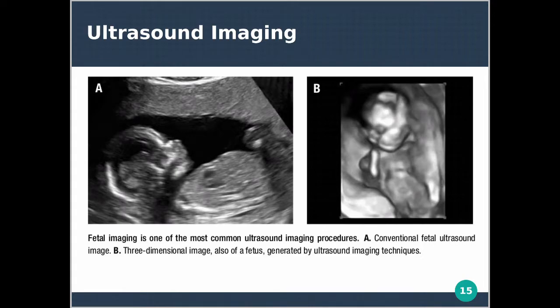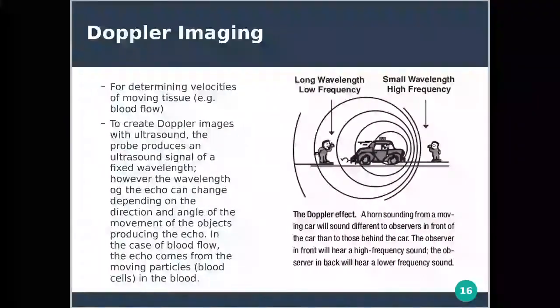Something like that. The 3D ultrasound imaging technique applies a similar concept to that. And you can see here the actual surface of the face of the fetus inside the womb. Unlike X-ray, where you can see through cross-sectionally, this one is a bit different. This is more for viewing the surface, but not so much the interior structure.